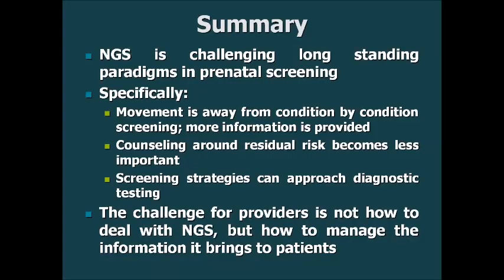In summary, next-generation sequencing technology is challenging long-standing paradigms in prenatal screening. Specifically, movement is away from condition-by-condition screening because more information is provided, and the need for residual risk becomes less important as we add more conditions and more variables to the screening platform.